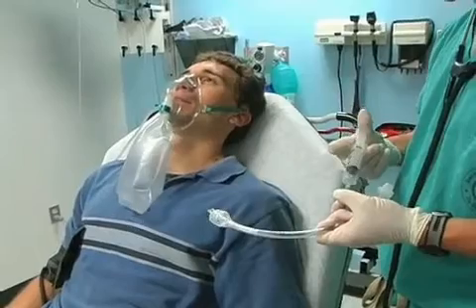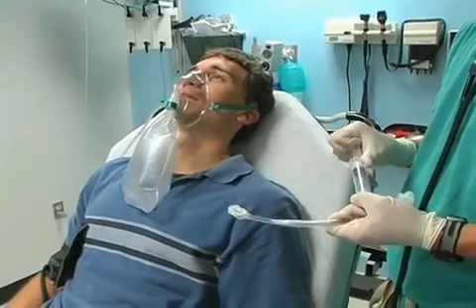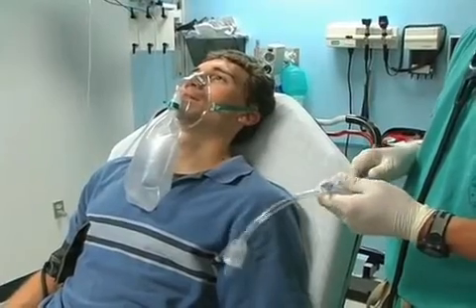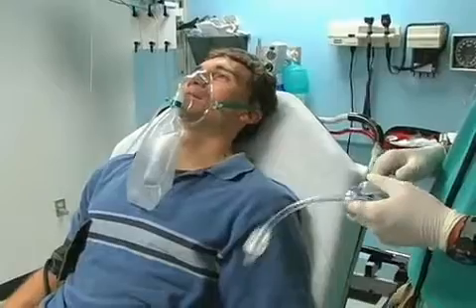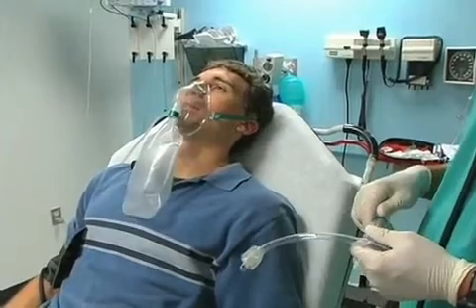Adequate ventilation and oxygenation must be ensured while the equipment is being prepared. Spontaneously breathing patients should be pre-oxygenated with a non-rebreather oxygen mask at maximal flow rates for 3 to 5 minutes. Sir, go ahead and take 4 deep breaths for me. A fully cooperative patient should be asked to take 4 maximal inspirations.